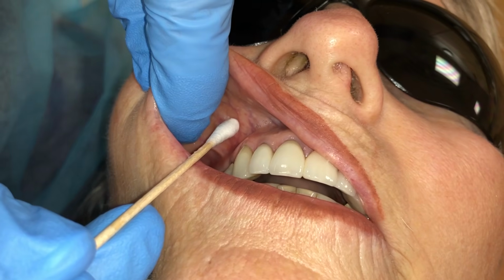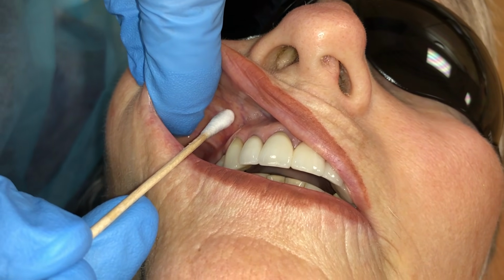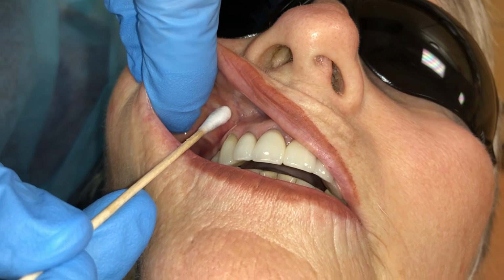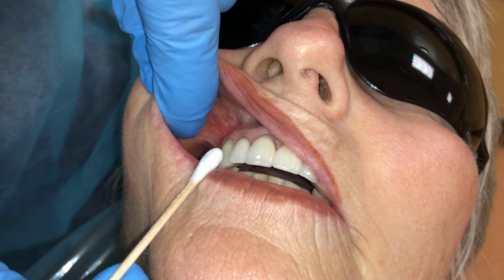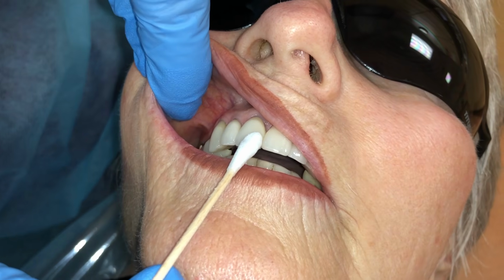The depth of penetration would be approximately 3 to 6 millimeters, and this injection would anesthetize the canine through the central incisor and the buccal soft tissue.